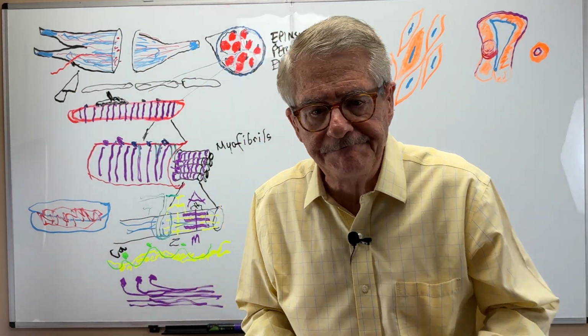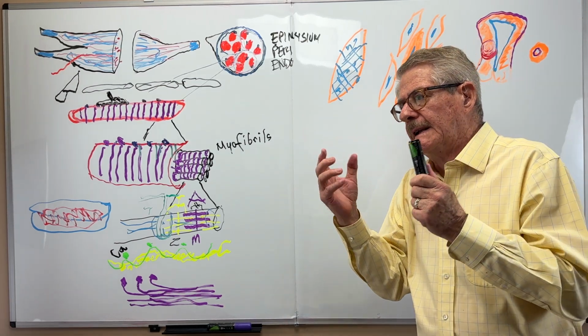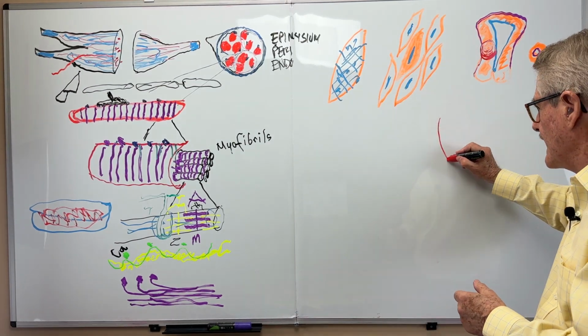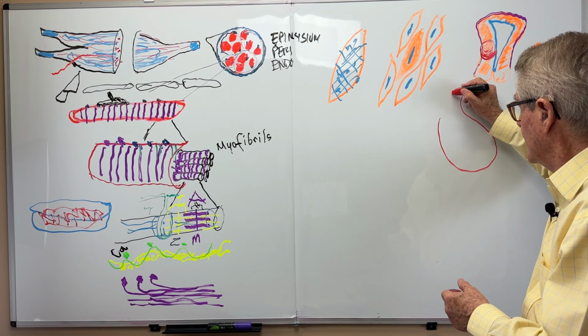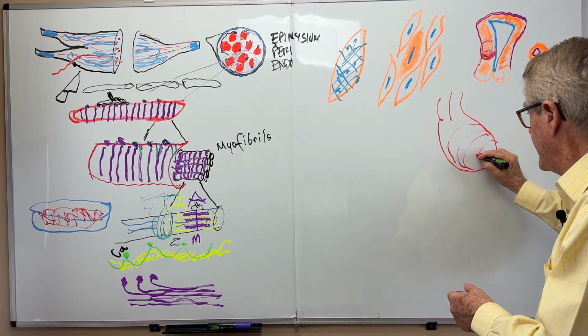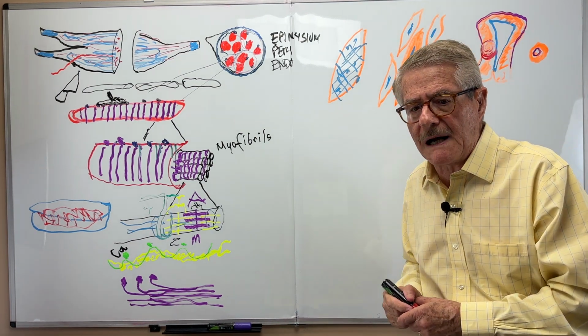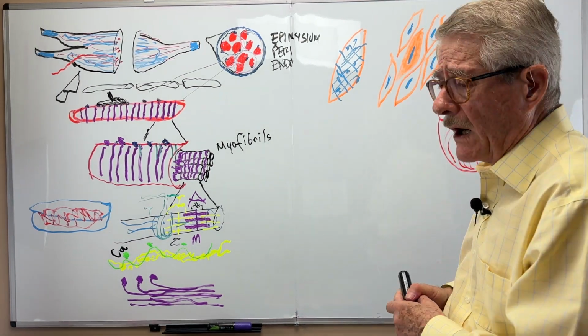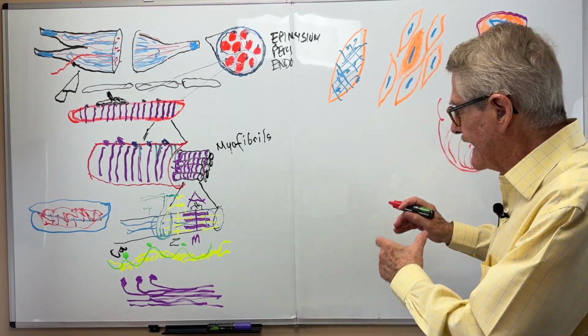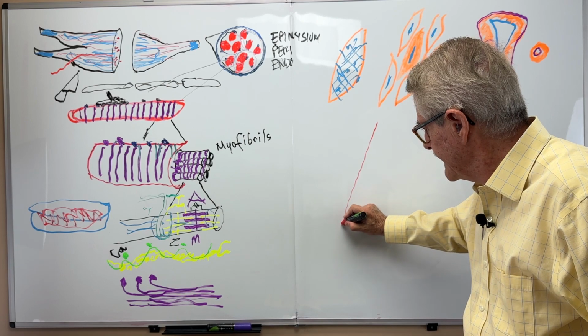We're going to go to the heart muscle. The heart has a heart shape, with the big vessels here, and the cells are going to be concentric around this hollow muscle, if you want. The heart is a hollow muscle, and the cells are elongated like this.